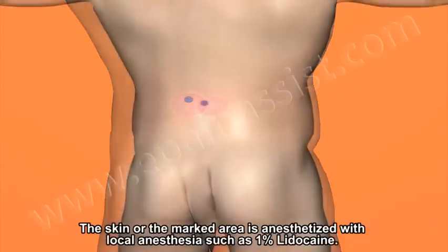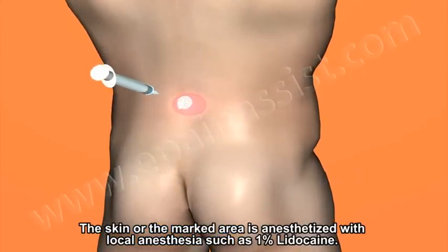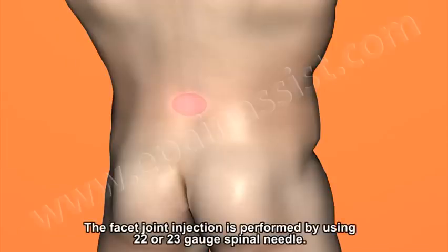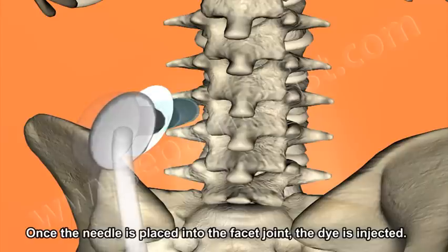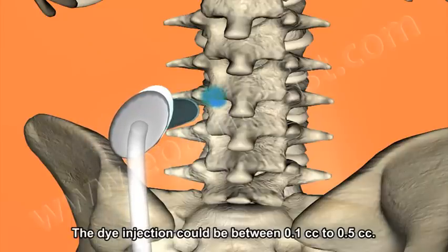The marked area is anesthetized with local anesthesia such as 1% lidocaine. The amount of lidocaine injected is 1 to 2 cc using a 25 gauge needle. The facet joint injection is performed by using a 22 gauge or 23 gauge spinal needle. The needle is passed under the guidance of the X-ray. The needle is placed over the facet joint and inserted into the facet joint. Once the needle is placed into the facet joint, the dye is injected. The dye injection could be between 0.1 cc to 0.5 cc.